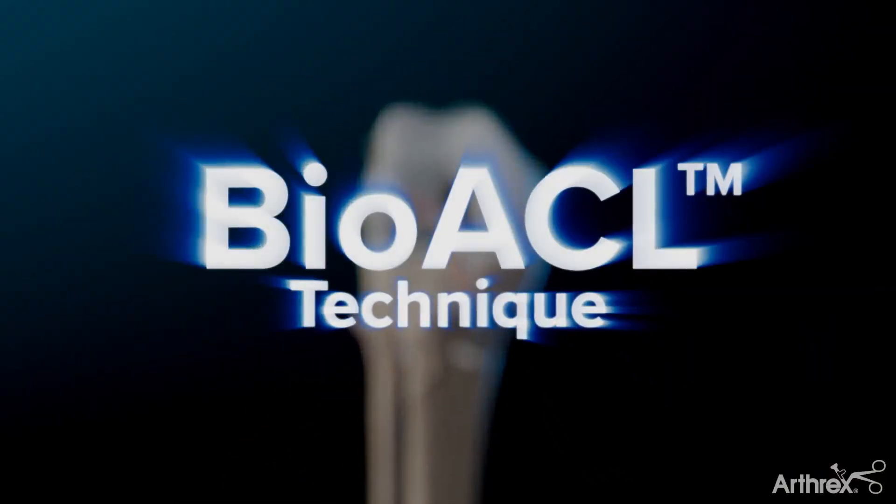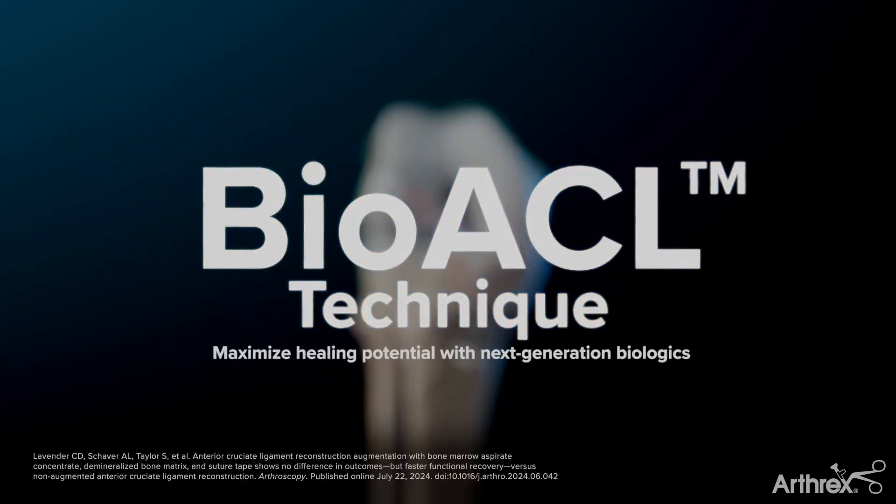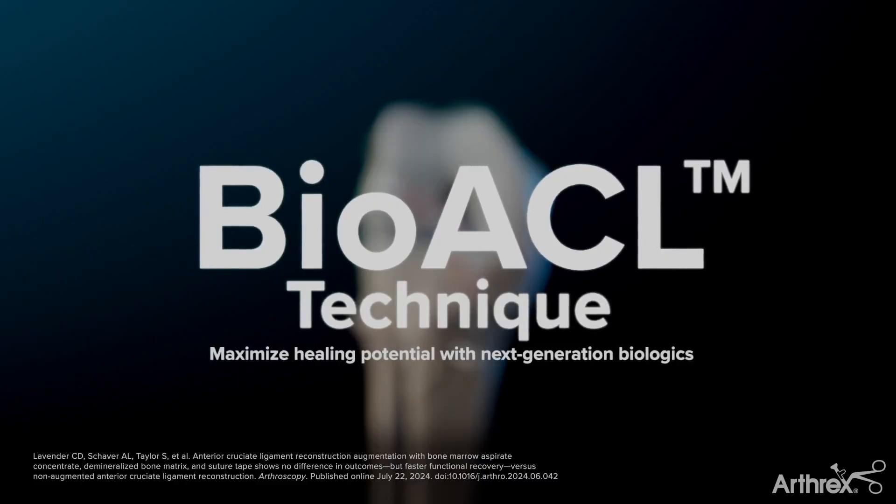The BioACL technique enhances ACL reconstruction by integrating next-generation orthobiologics to improve functional outcomes and reduce tunnel widening.